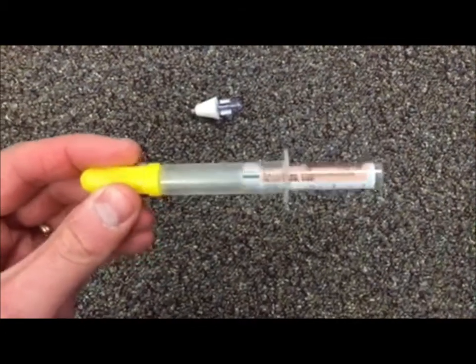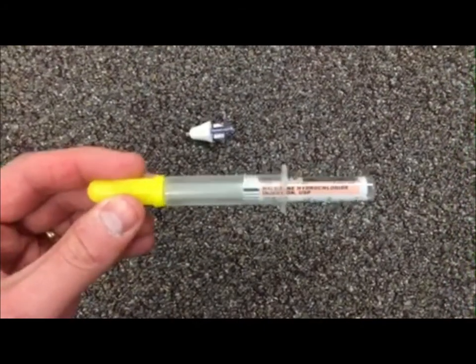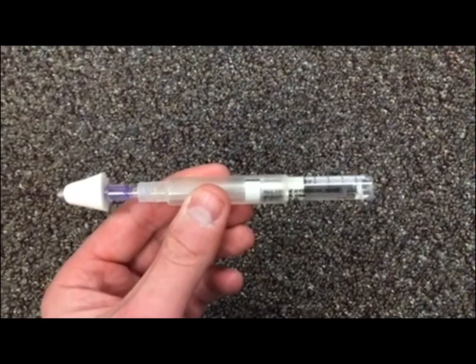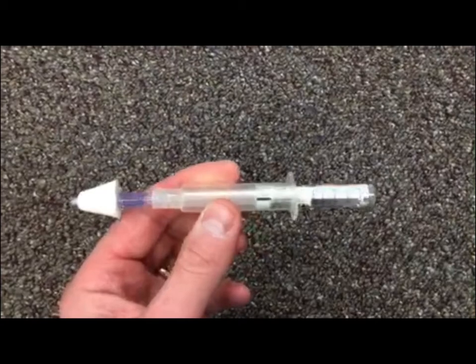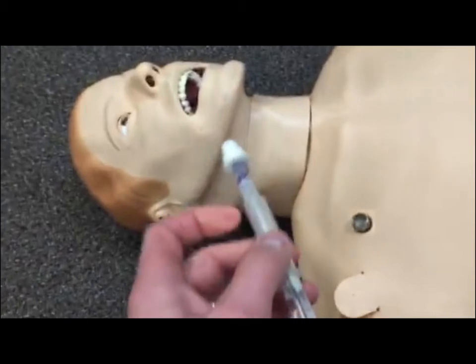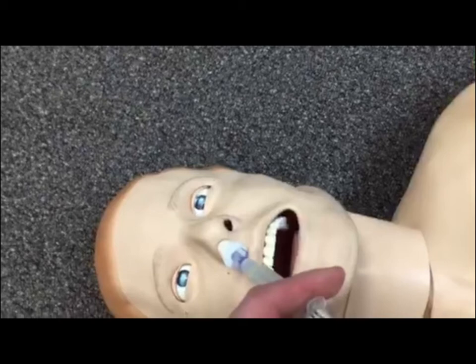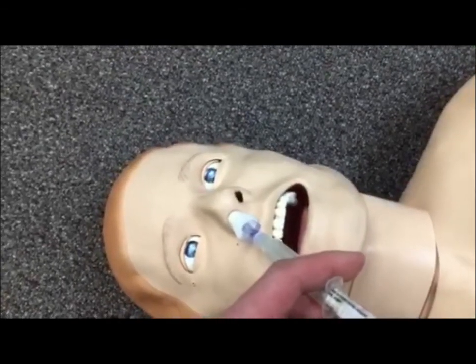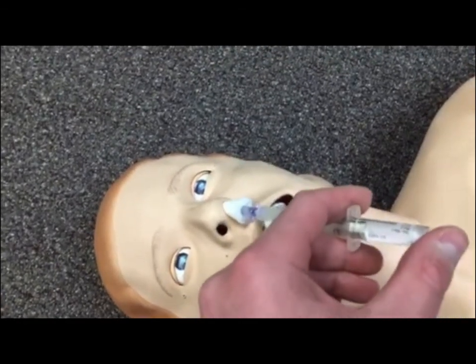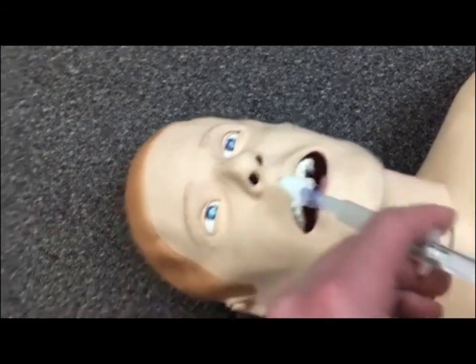Okay, once we have screwed on the vial of medication here, we're going to remove the yellow cap on the end of the syringe here, and we're going to affix our MAD device to the end of this. Once we've done that, this will leave us with something that looks like this, and we're ready to inject. So we'll come over to our patient here. You're basically going to stick this device up into the nostril and depress the syringe down to the 1 milliliter mark. When you're done there, you're going to switch it over to the other nostril, and you're going to depress the syringe and give the other milliliter up the nose here.